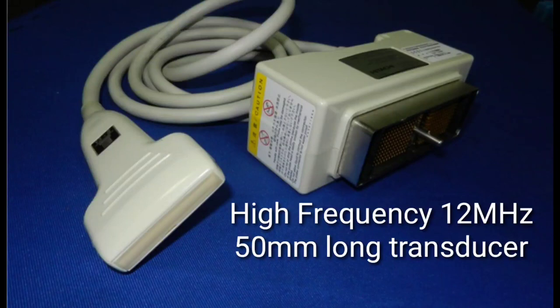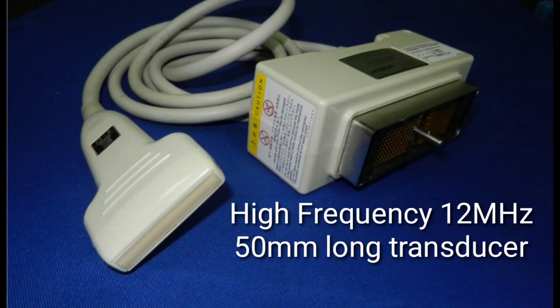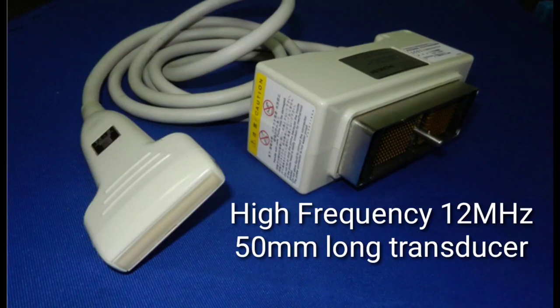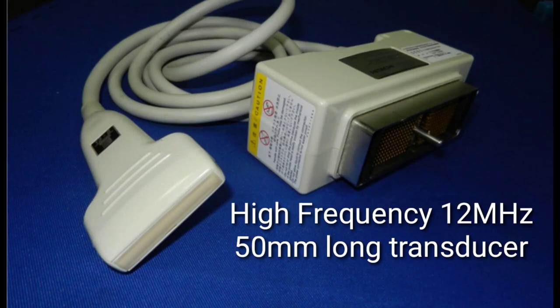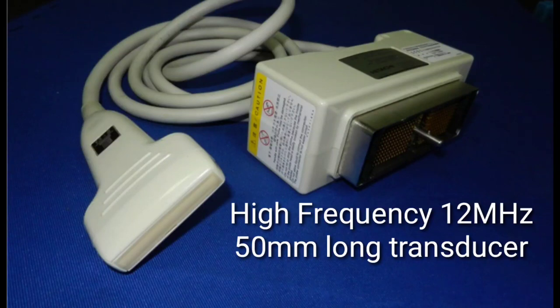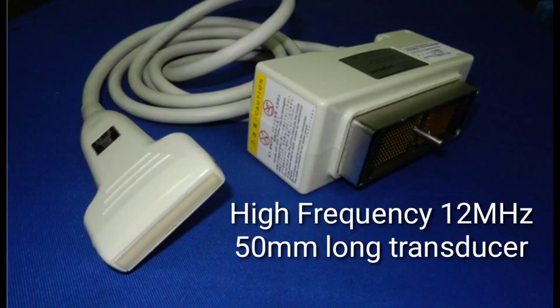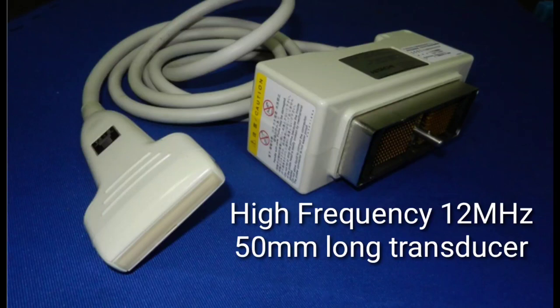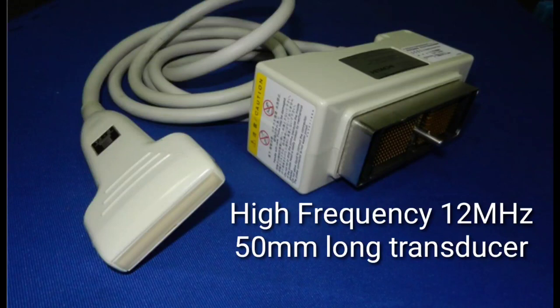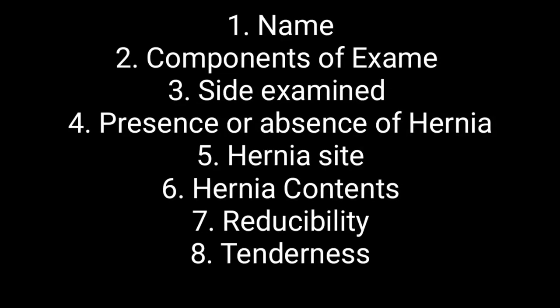The use of a 50 mm transducer is important because it has a larger field of view and allows better identification of landmarks, especially when the patient has diastasis of aponeurosis. When long-footprint linear transducers are not available, a trapezoidal or virtual convex display can be very helpful. Try to use the biggest footprint 50 mm long transducer with high resolution of 12 MHz, and if the patient is obese, use 7 to 9 MHz curved array.